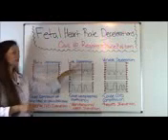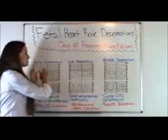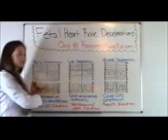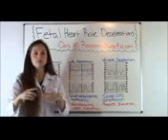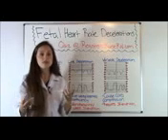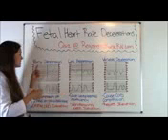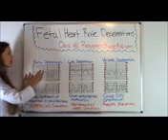On the top of these tracings, these are the fetal heart rates. Okay? So tops are fetal heart rates. Bottom is mom's contractions. What this is showing us, it's able to tell us when mom's having a contraction and how the baby's heart rate is responding to that contraction. These little numbers on the side, because fetal heart rate is at the top, it measures the heart rate.